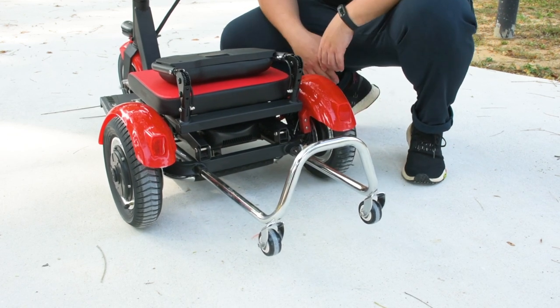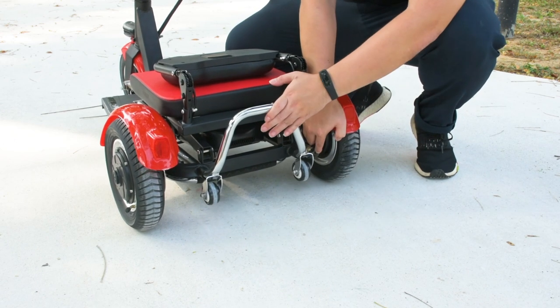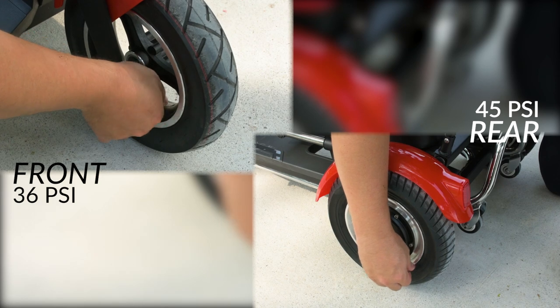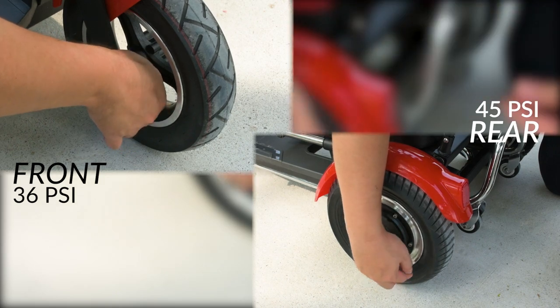The wheels at the back help to prevent overturn, which is an important safety feature that greatly minimizes the likelihood of the Flexi Pro falling backwards during sudden acceleration or when traveling up slopes. The 10-inch pneumatic wheels need to be pumped to 45 PSI for both rear wheels and 36 PSI for the front wheel, so check on them regularly.